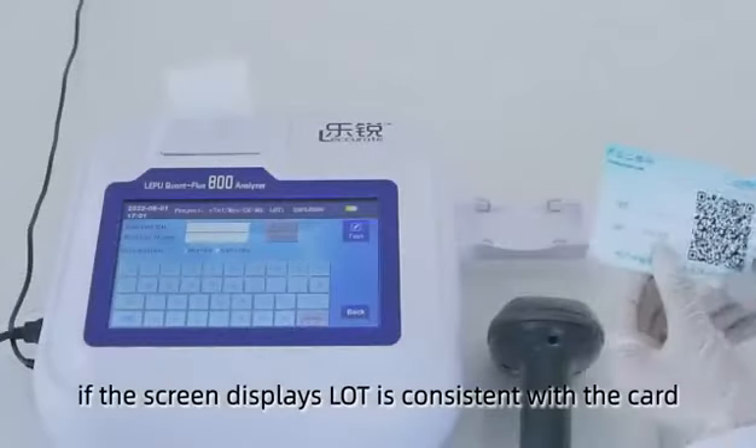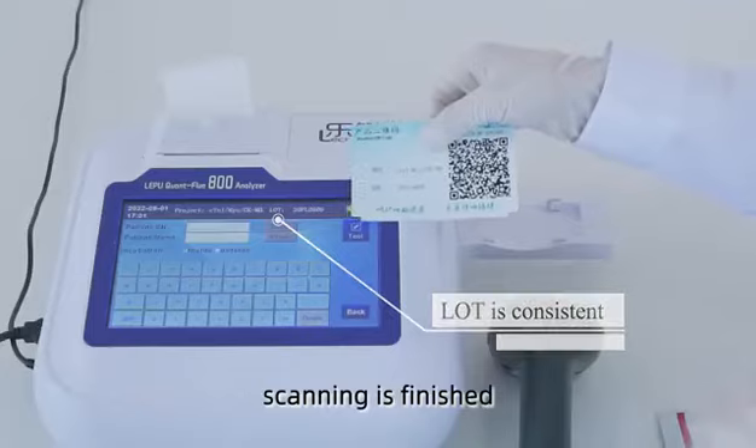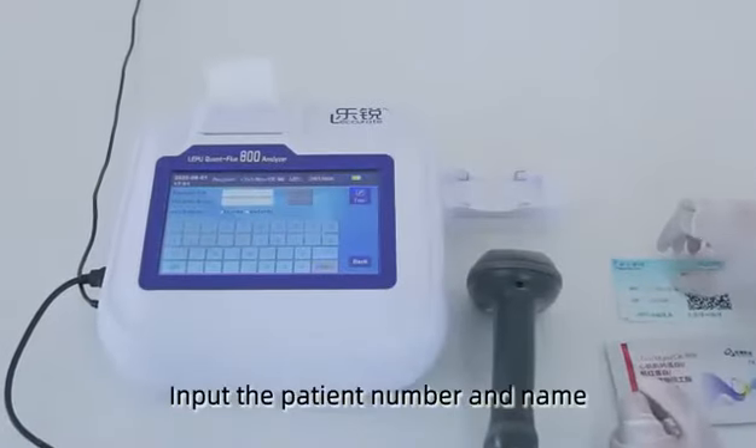If the screen display light is consistent with the card, scanning is finished. Input the patient number and name.